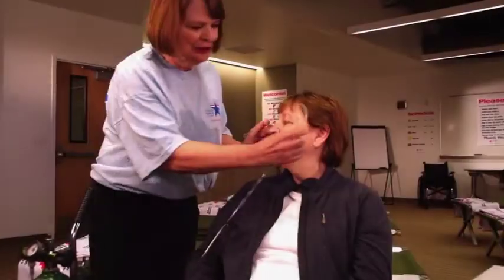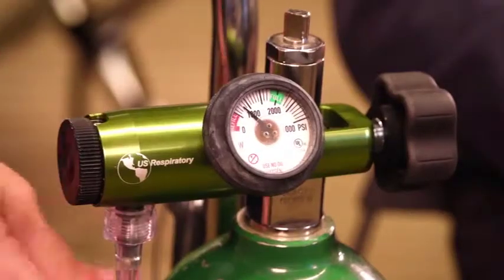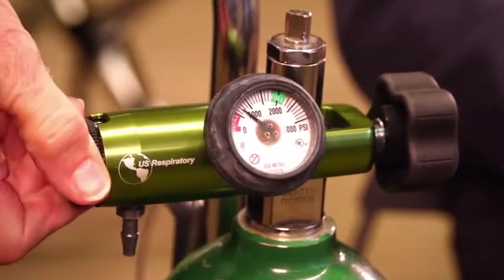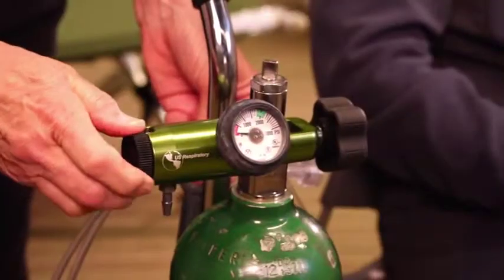When not in use, turn the tank off using the key and turning in a clockwise direction. Bleed the tank using the flow meter. Turn the flow meter completely off when you do not hear the oxygen escaping.